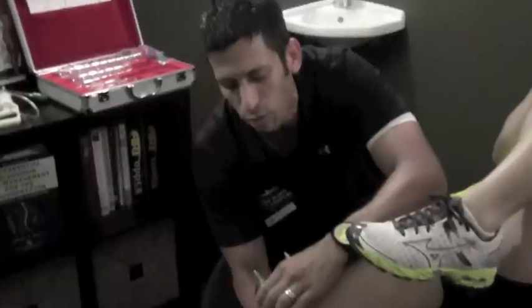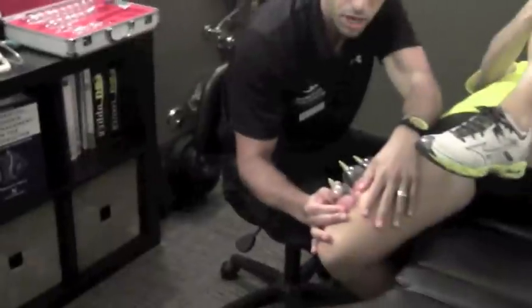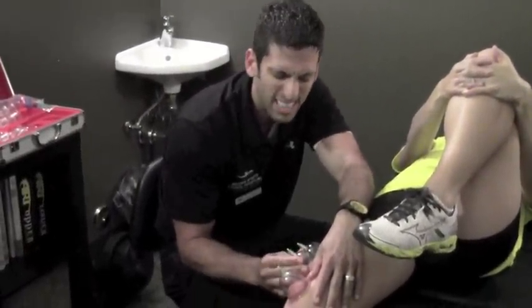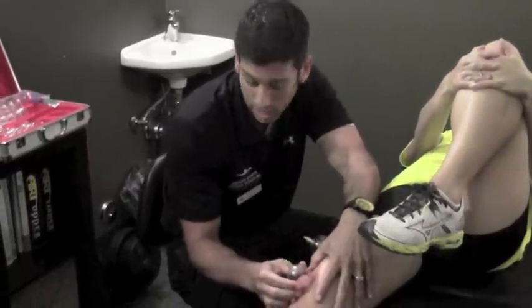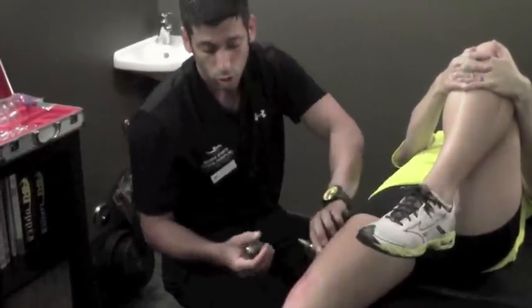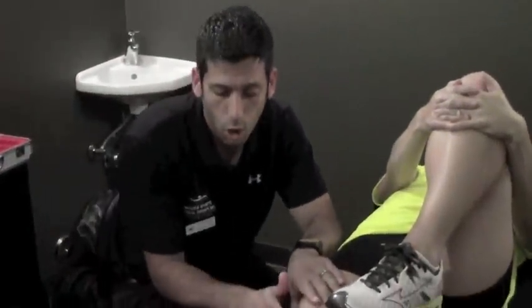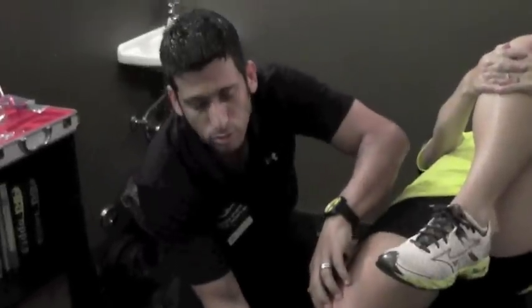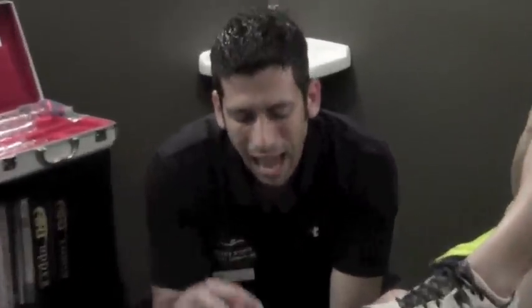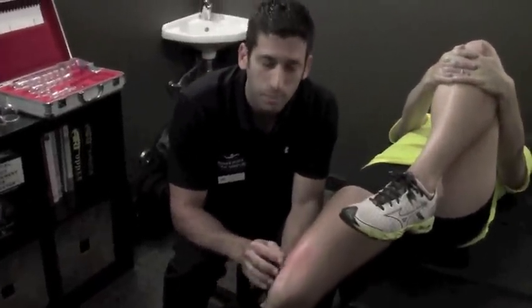Instead of pushing down on tissue, which is traditionally what massage therapy, physical therapy, and chiropractors do, we're doing negative pressure — pulling up the skin and fascia into the cup. When we pull back it increases the tension, and that pulling is taking the fascia and stretching it along the pathway you desire. It does leave some bruising sometimes for two days up to a week. This is very effective in helping with chronic IT band tendonitis, patellofemoral pain, patellar tendonitis, and knee bursitis. Very effective.